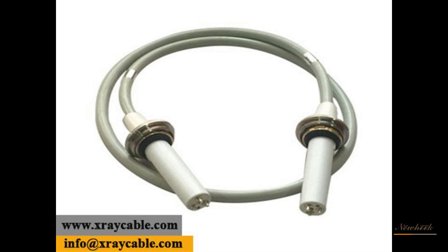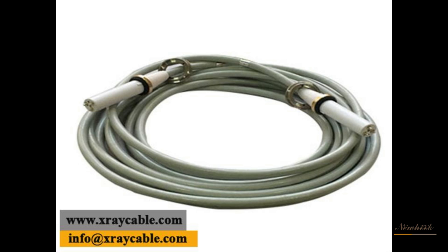Newheek X-ray machine high-voltage cables are available in 75 kV and 90 kV ratings, and the length can be chosen arbitrarily.